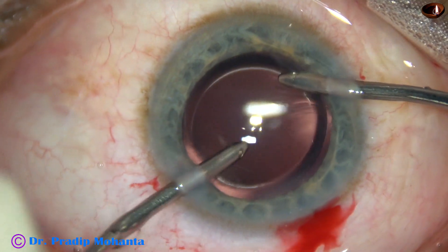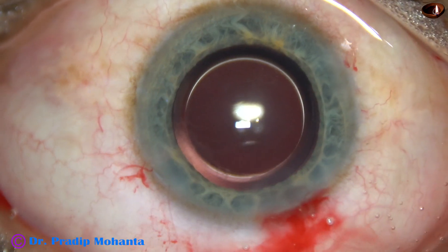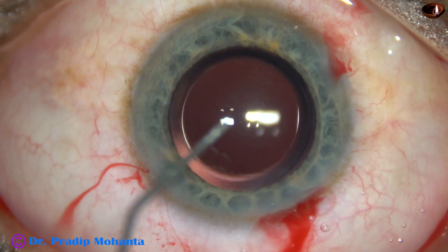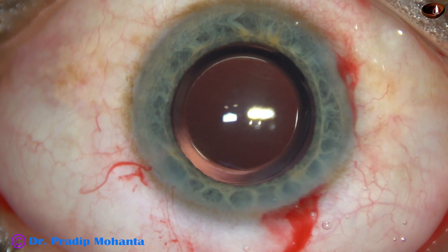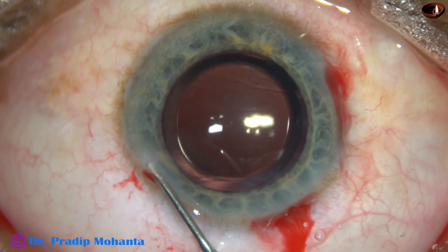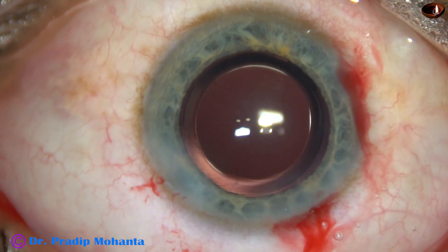Thorough cleaning of visco is very much necessary to avoid post-op rise of intraocular pressure. Retained visco can cause high rise of intraocular pressure and steamy corneal edema. The patient becomes very uncomfortable because of retained visco. This is moxifloxacin. The side ports are closed by hydrating the corneal stroma with a 27-gauge cannula and BSS.